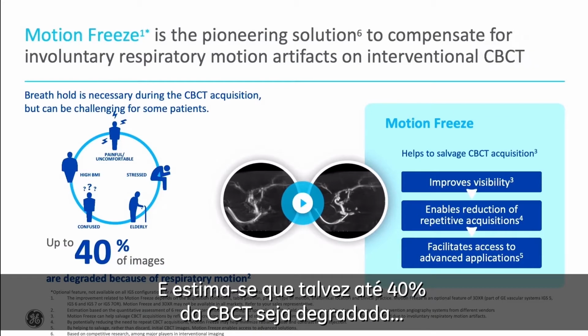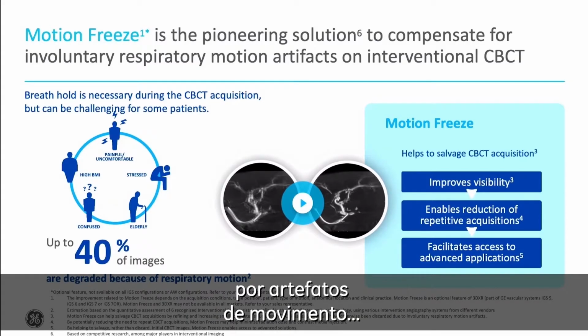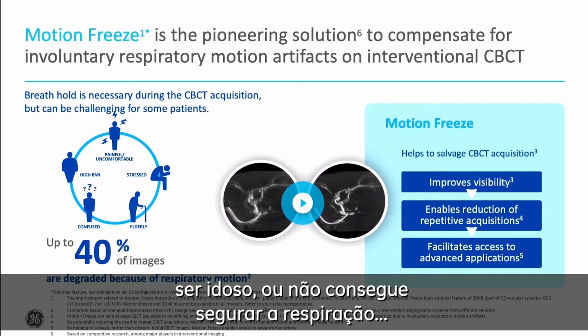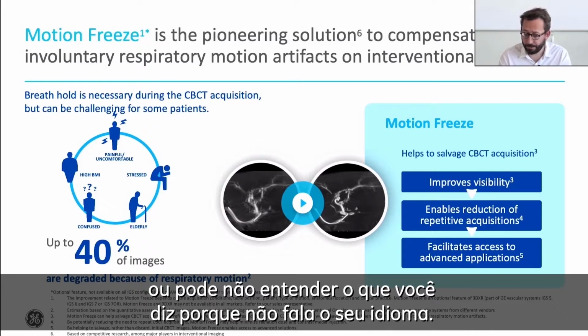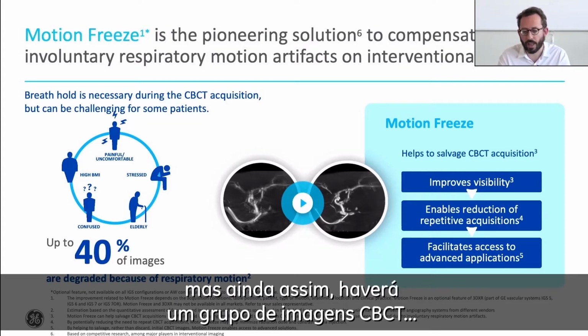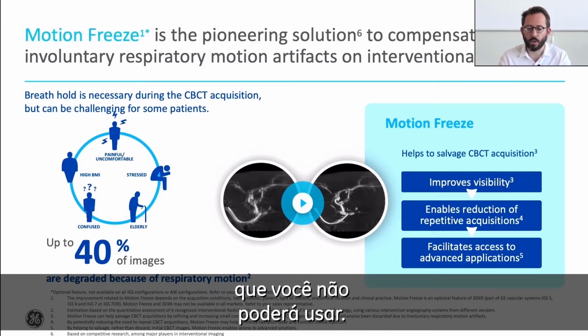if there are motion artifacts, you will not be capable of using those very nice imaging data for your treatments. And it is estimated that maybe up to 40% of CBCT are somehow degraded by motion artifacts, because patients may be too weak, too old. They may not be able to hold breath, or they may not understand what you say because they don't speak the same language as you. So you can practice with them before the treatment, but still you will have a subset of CBCT images you will not be able to use.